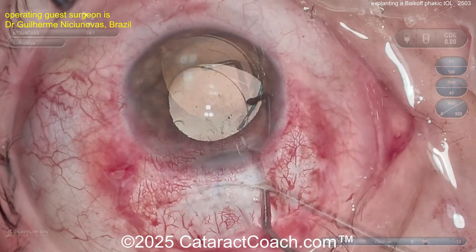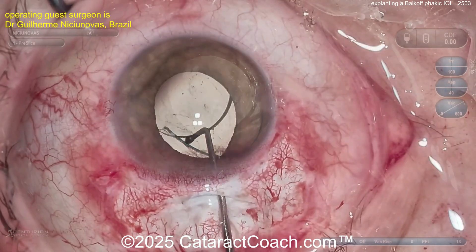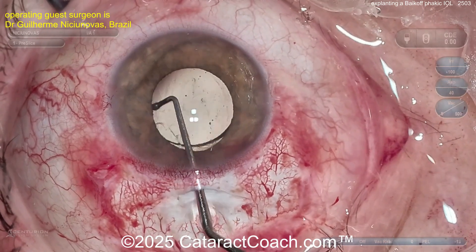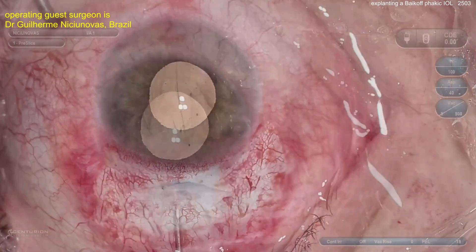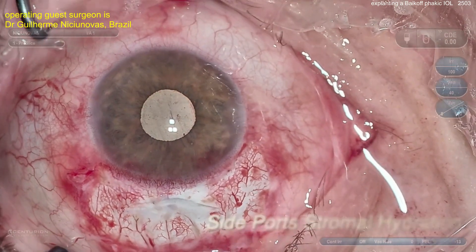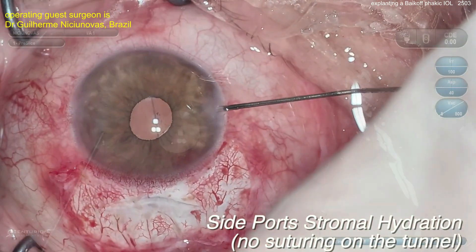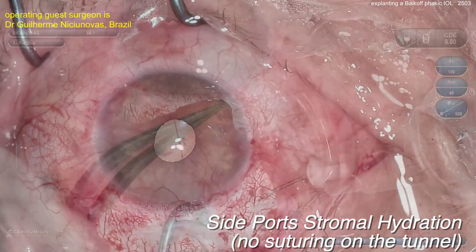Here comes the zero power lens being delivered very gently into the capsular bag. You've got a nice rhexis too — it should go in beautifully. Remember, don't aim for dead-on plano; let these patients be just a little myopic — minus a half would be a blessing. Sealing up the incisions — the scleral tunnel is so long it seals on its own. Hydrate the stroma of the side ports, and bring the conjunctiva down.